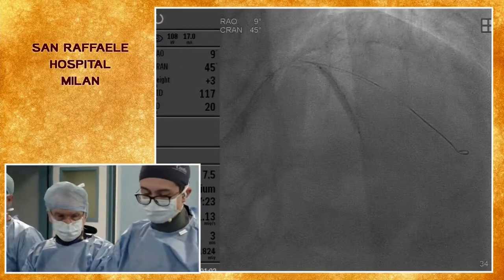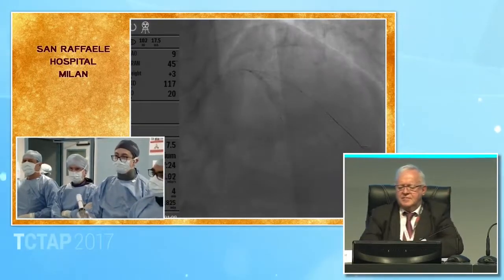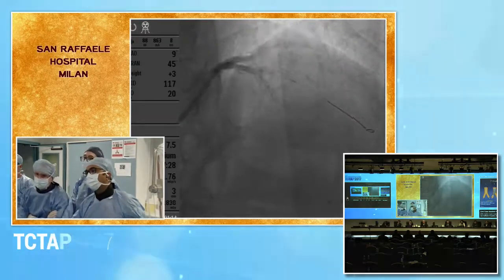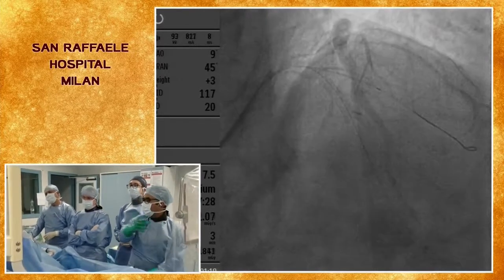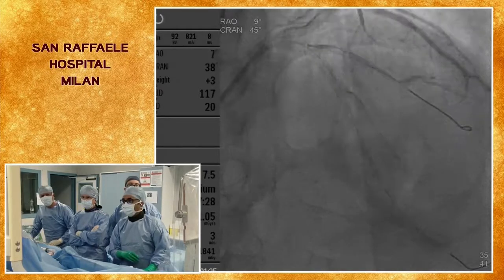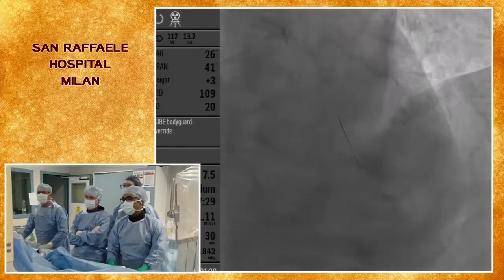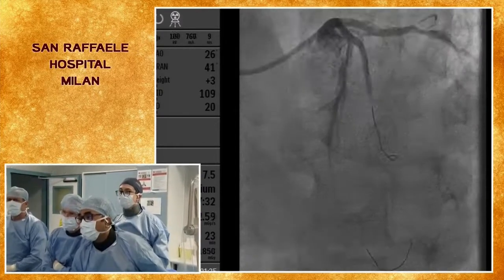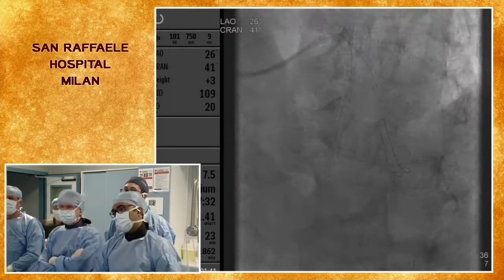Okay. Some residual waist in the proximal part. Sirolimus-eluting. Okay, let's do an angio. Take a picture. I think it's fine. It's better. Let's see, separate the septal there. You know, I understand that you see a dissection distally, but again, the lumen looks fine. It's a linear dissection, extraluminal.